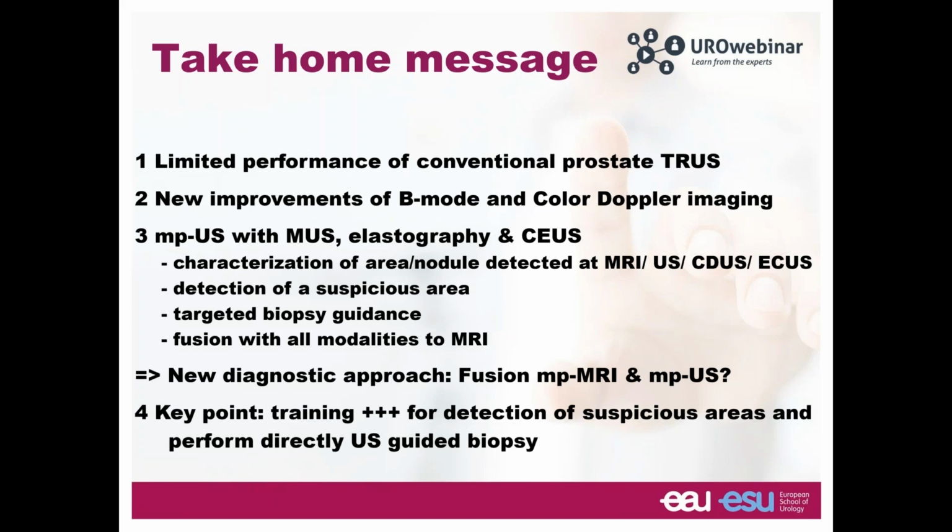So my take-home message will be, you'll see, or you have seen, that conventional prostate transrectal ultrasound has a very limited performance. There is some significant improvement now on B-mode imaging and color Doppler imaging using many tricks developed by manufacturers. Multiparametric ultrasound has become real, and the improvement can also be achieved through the use of much higher frequency, like micro, high frequency, high resolution ultrasound.